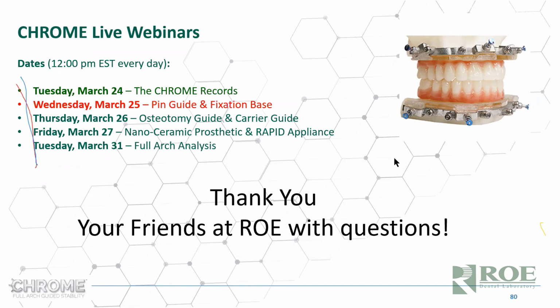There's two issues with that. One is if the denture is seated, then we can work with occlusion. Because we can turn the denture on and off, unlike dentate, we can turn it on and off within the CT scan. It's very easy for us to plan trajectory of implants and where they're going to come out in the occlusion. The other is often staff, anyone, you put the patient in the CT scan, you have them bite on the bite fork, the back of the denture tips up every time. And that's a red light. We have to get another scan. So just have the patient biting on cotton roll. I mean, bite in occlusion every single time.